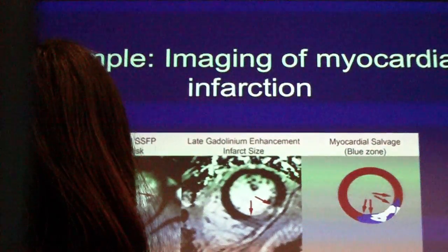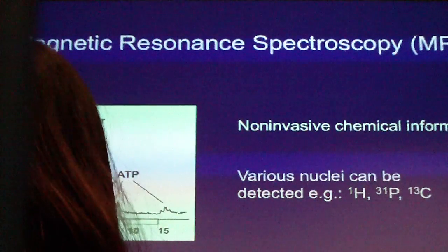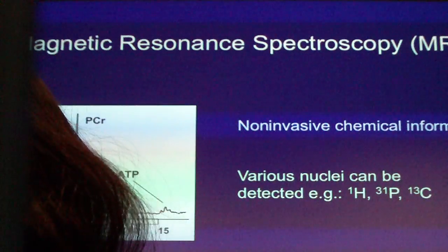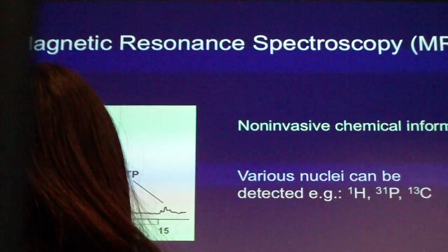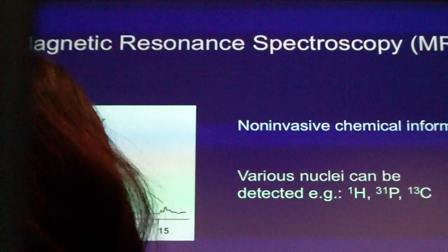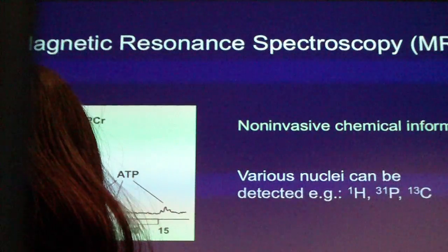Okay, so that's a bit how you can use these images. And now, I also want to talk a little bit about magnetic resonance spectroscopy. So in the beginning, I said, okay, it's with the same physical principles, also with this magnetization, that you want to bring in another plane to have it measured, and relaxation mechanisms.